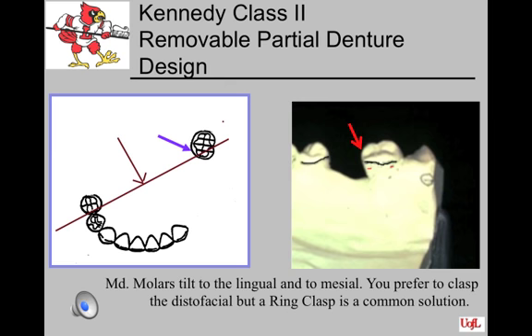That survey line is so high on the mesial lingual that I have to really cut the surfaces of that tooth down to be able to make it so that the first 2/3 of my direct retainer is all above the survey line. So I use the most severe undercut position for the terminal end of my direct retainer, which would be the mesial lingual.